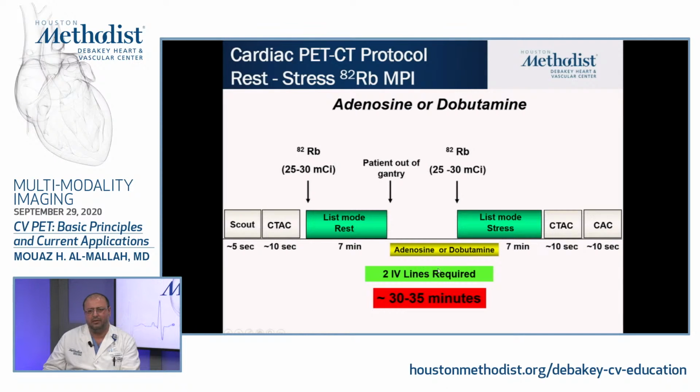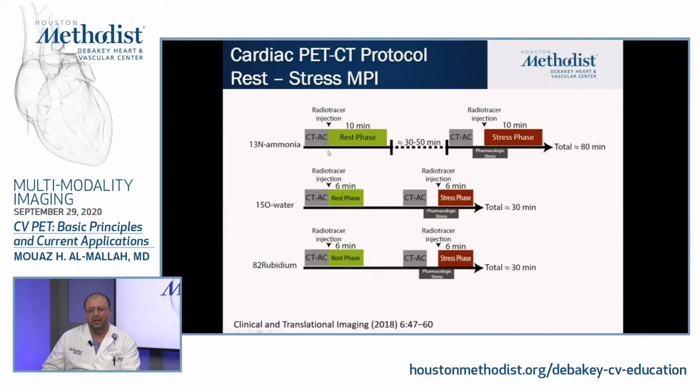So you need to look at the logistics of injecting so you don't result in a bolus of adenosine and cause AV block. So that's why you need to have 2 IV lines, or if you have one of those lines where you have a 3-way where you can switch the 3-way to allow for injection without resulting in a push of adenosine from the tubing. And we covered some of these protocols with ammonia.